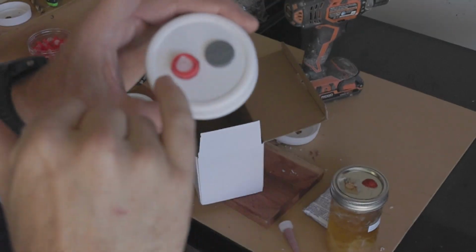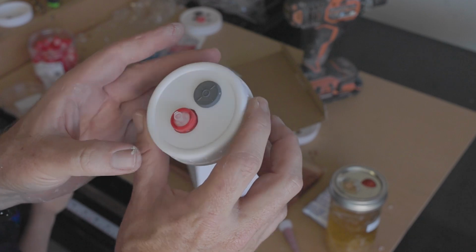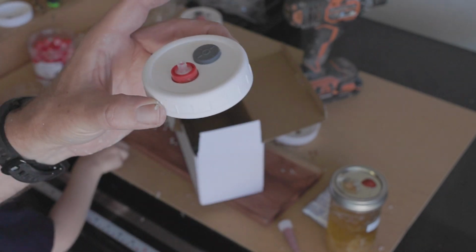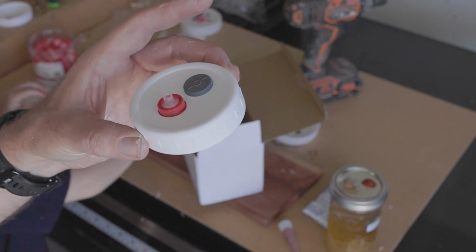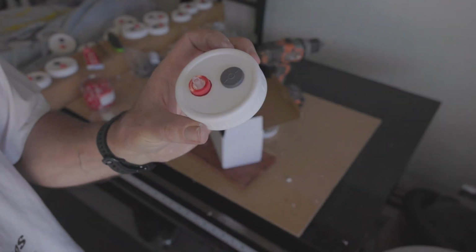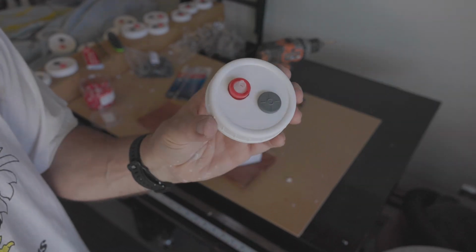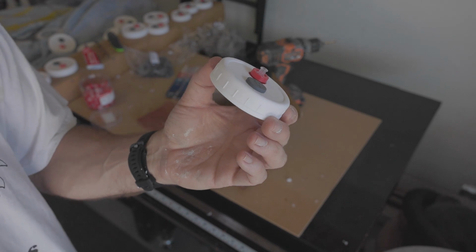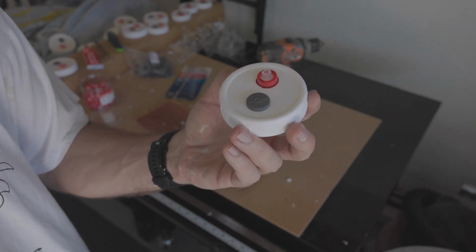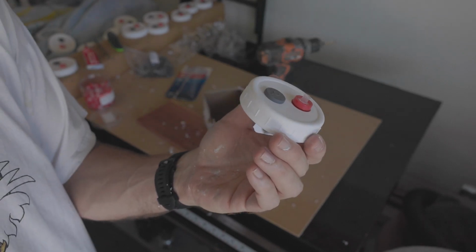But again, I'm pretty sure that is completely unnecessary. That fits in there plenty tight. But for good measure, I'll do a couple of them. Why not? There you have it. Pretty straightforward, simple build. Might save you a few bucks. I think these are going for about 5-10 bucks online, already made. You can make it yourself, probably spend just as much money, but you'll have a complete set.